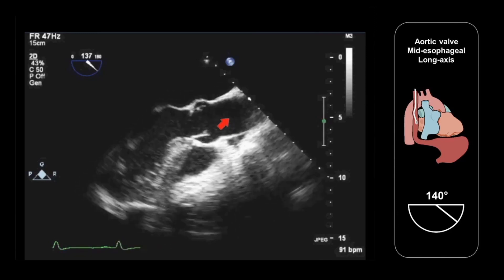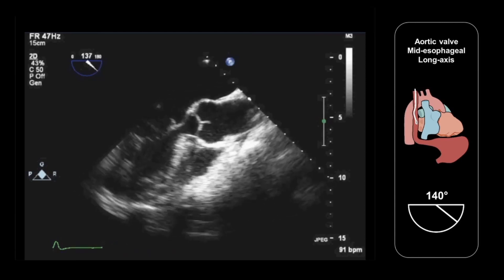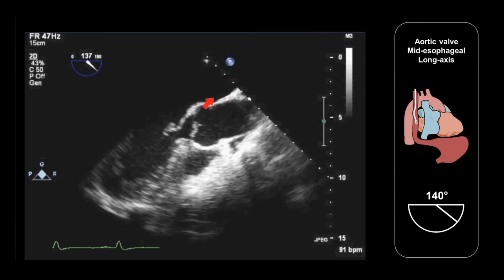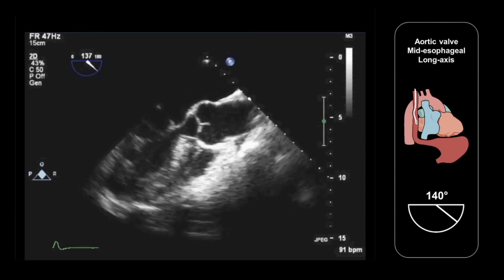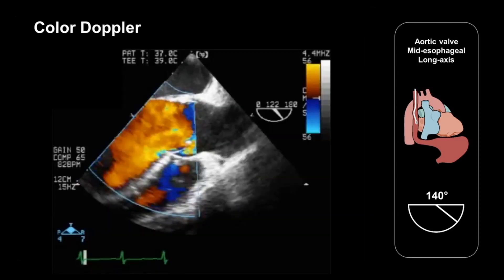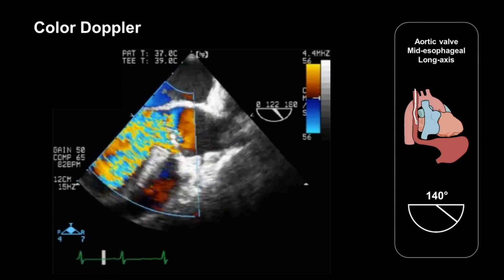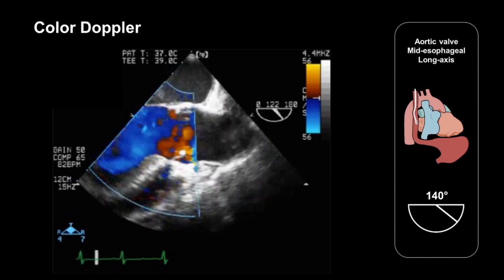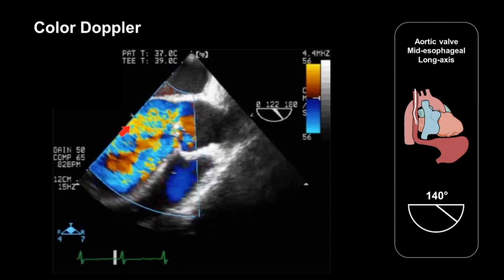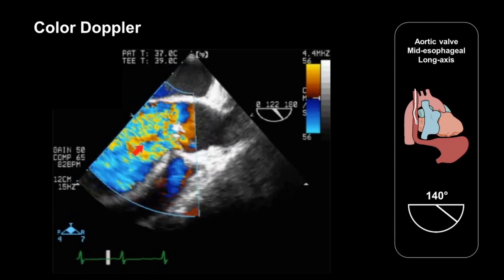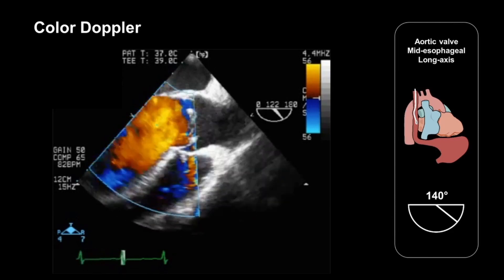We discuss the aortic root in more detail in our chapter on the aorta. Once we've assessed the anatomy of the aortic valve and neighbouring structures, we should apply color Doppler to assess flow through the valve. Here we have color Doppler applied in a patient who has severe aortic regurgitation as a consequence of infective endocarditis. We can see this diastolic, very broad jet of turbulent flow, which corresponds to severe aortic regurgitation.